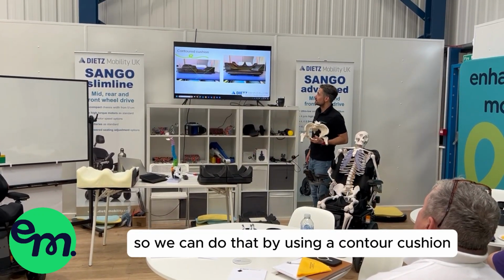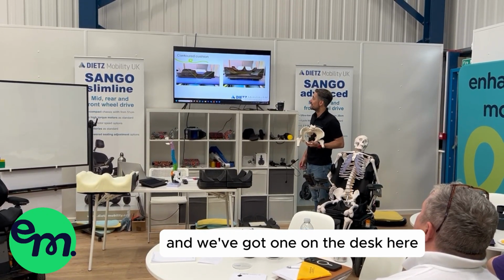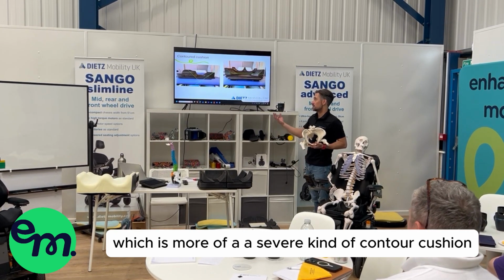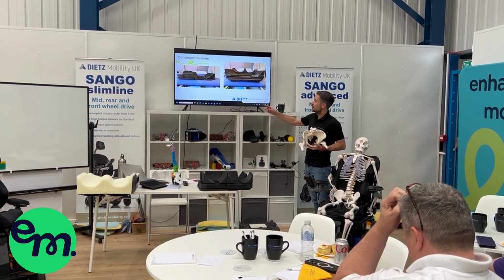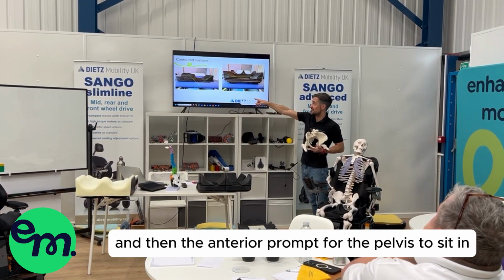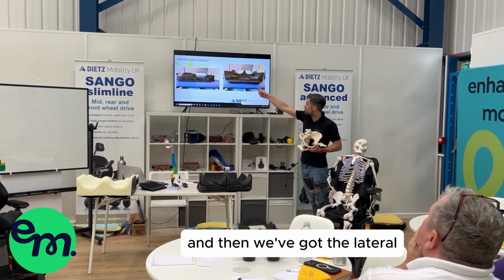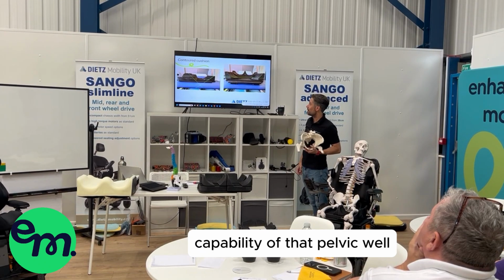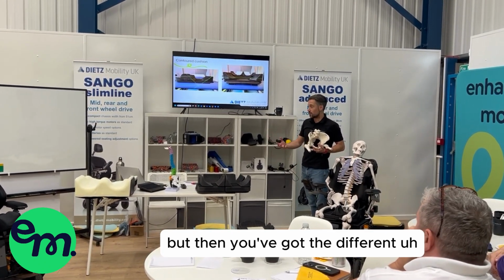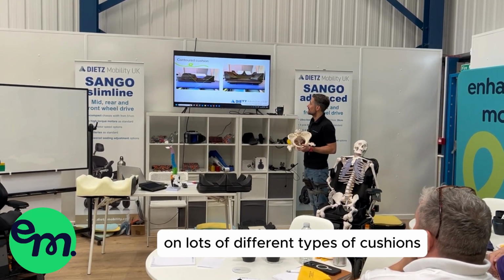So we can do that by using a contour cushion, and we've got one on the desk here. We've got the domino cushion, which is more of a severe kind of contour cushion, but it's giving that quite distinct posterior prompt and then the anterior prompt for the pelvis to sit in. And then you've got the lateral capability of that pelvic well. There's a lot of talk around pelvic wells, but then you've got the different diameters and different distances there on lots of different types of cushions.